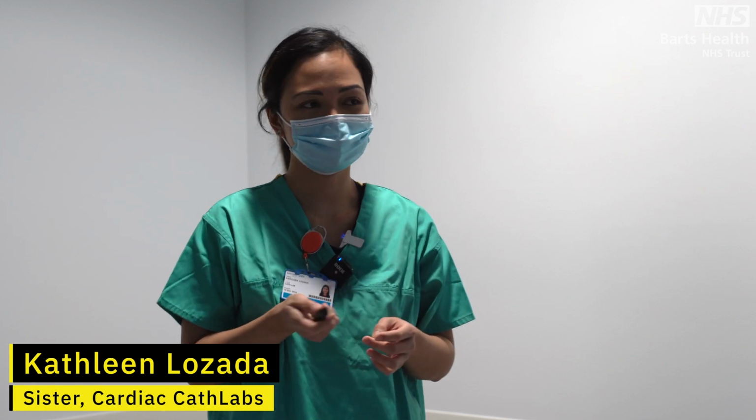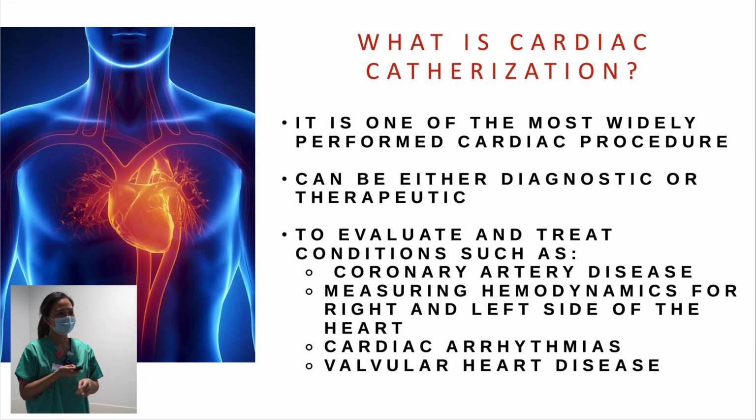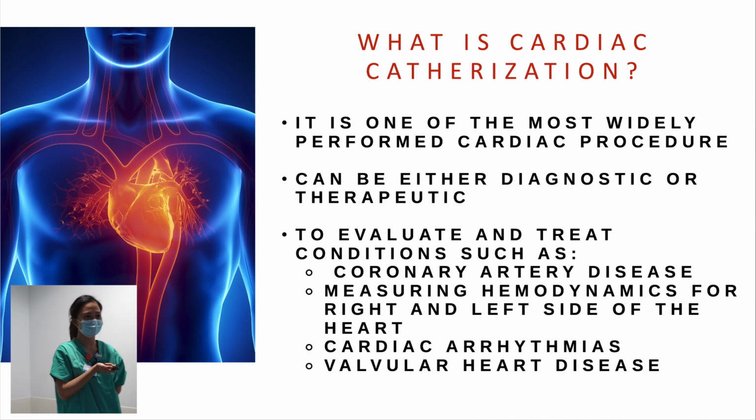Today we're going to talk about cardiac catheterization risks and complications. So what is cardiac catheterization? It is one of the most widely performed cardiac procedures, and it can be either diagnostic, in the case of the angiogram, or therapeutic for PCIs. It's used to evaluate and treat conditions such as coronary artery disease, measuring hemodynamics for the right and left side of the heart, cardiac arrhythmias, and valvular heart disease.